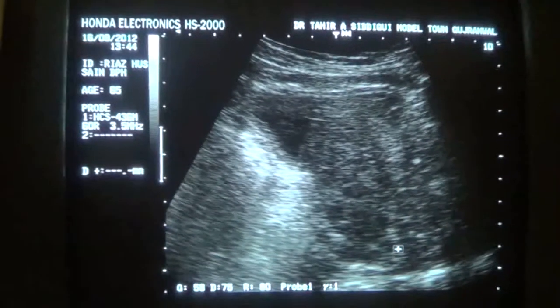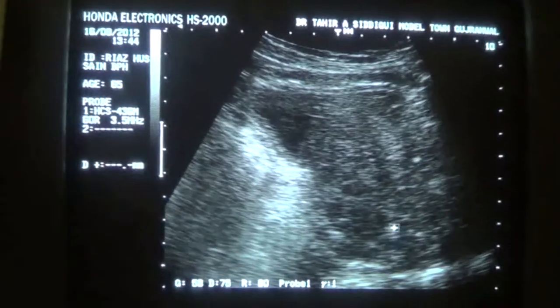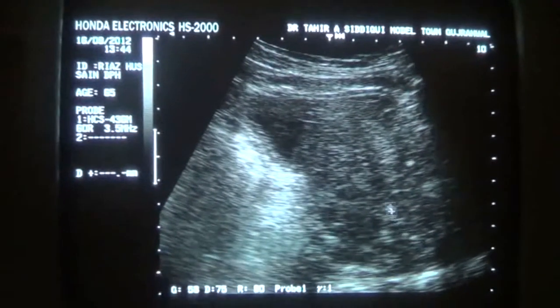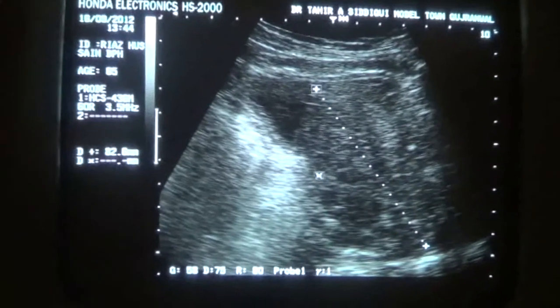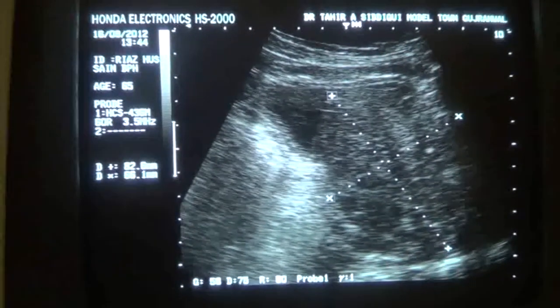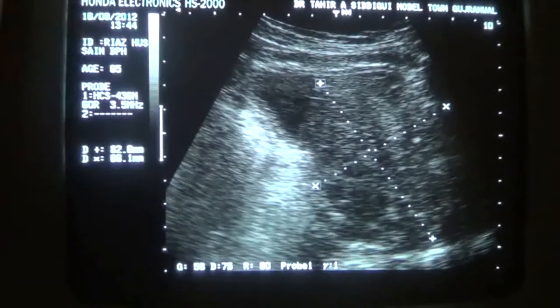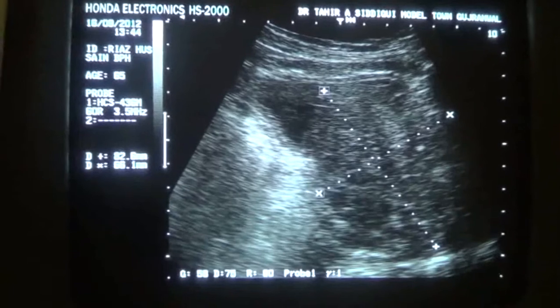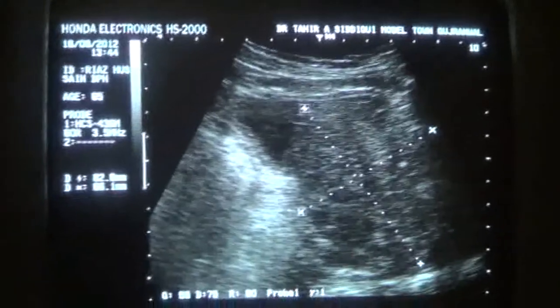So there are multiple hypoechoic areas along with multiple tiny echogenic areas within this inhomogeneous appearing prostate in longitudinal section. So far there is no periprostatic extension, the post-micturition residual volume is within normal, and there is no evidence of urinary bladder outlet obstruction despite the significantly enlarged prostate.